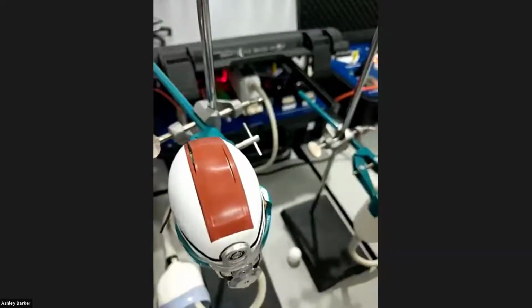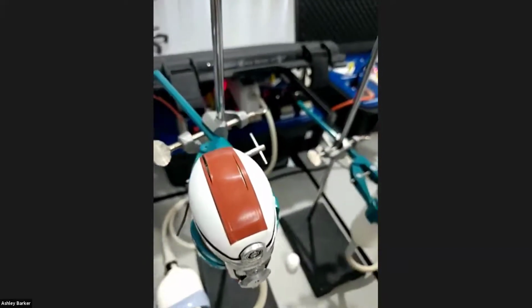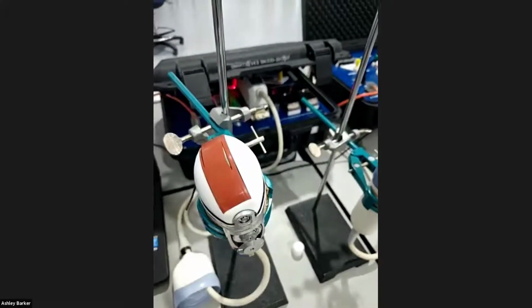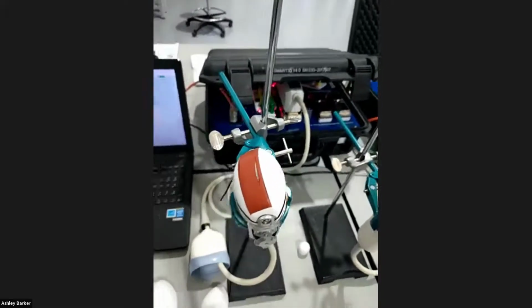Has that been cut, or is that split? I don't actually know what's caused that one. That is the only one I've ever seen do that, and it came from overseas. So if I had to guess, I'd say somebody else has probably tried to fix it and used the wrong oil, would be my best guess.